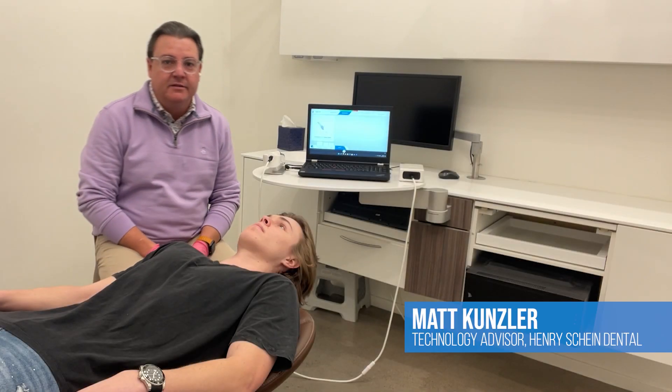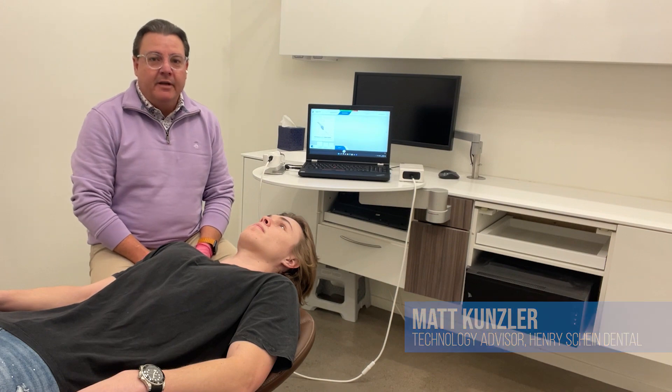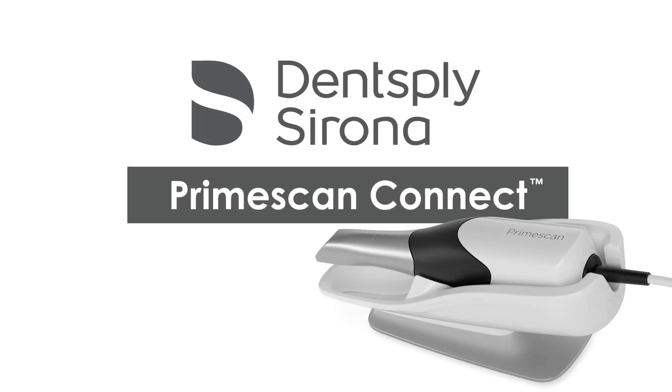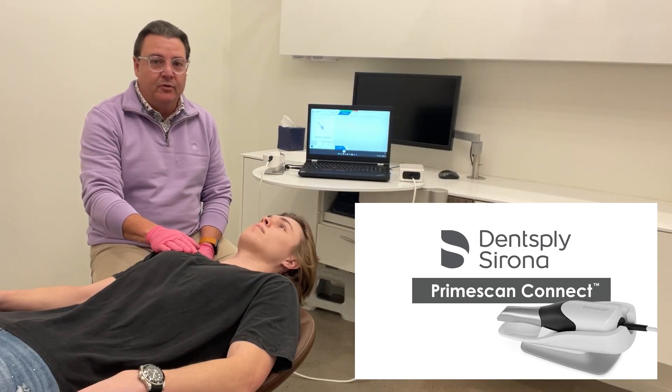Hey everybody, my name is Matt Kunzler. I am a technology advisor with Henry Schein. I'm here today to show you a little bit about the PrimeScan Connect unit from Dentsply Sirona. This is my handsome son Colin. He's going to be my demo patient.